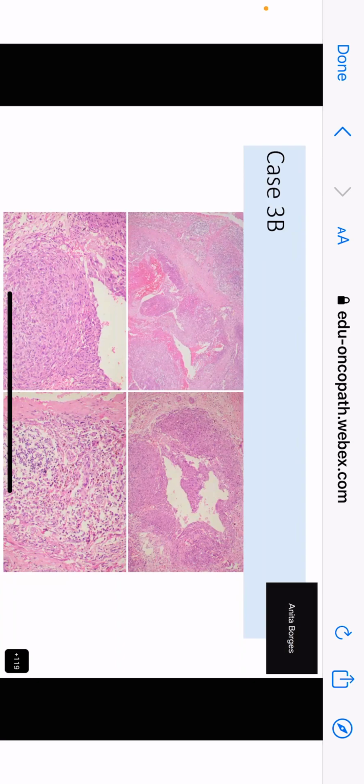Ma'am, I thought the blood vessels were lined by endothelial cells. Blood vessels. Which blood vessels? You don't think that these spaces are part of this tumor, or they're just there by the way? But because it is such a characteristic part of this tumor, right? And they're lined by endothelial cells. So it's a bit odd for it to be a blood vessel tumor. But anyway, you said blood vessel tumor. Yes, ma'am. Right, very good.